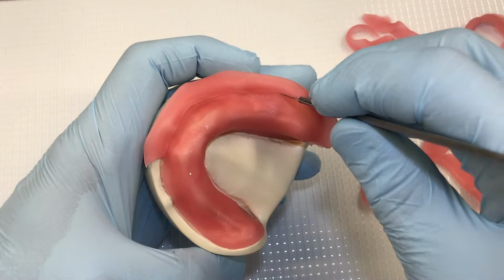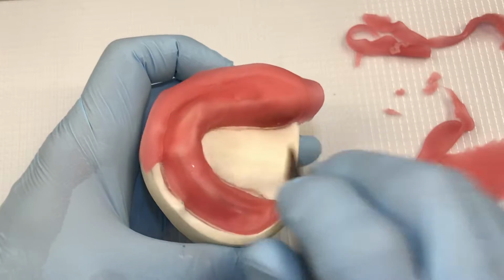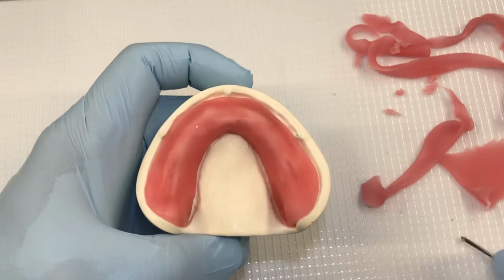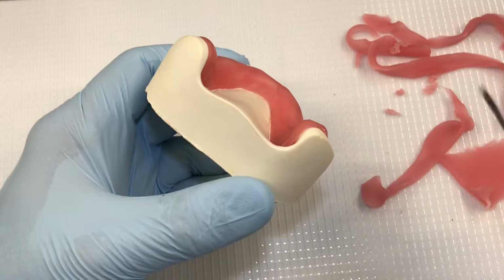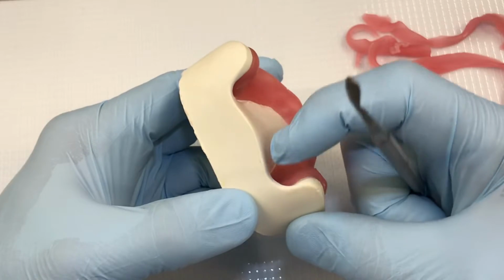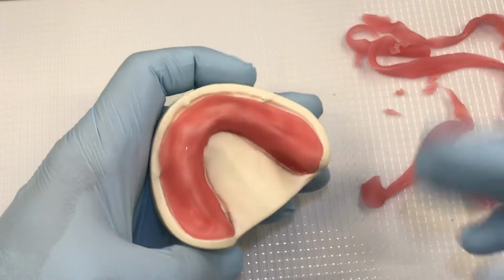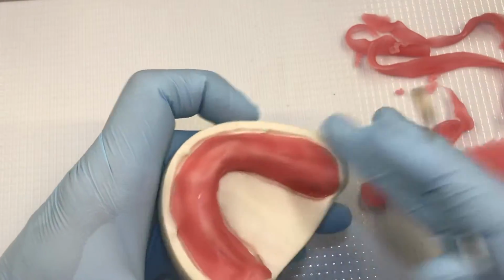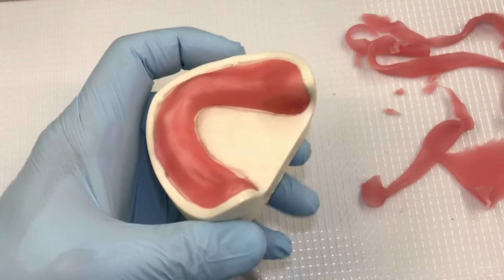And as you're cutting through the material, you can feel your blade having a bit of a resistance as it cools off. So you have to go back and heat it and put it back and continue to the next section. If you notice back here, as I was cutting it, I created a little bit of space. You need to go back in and readapt the material for obvious reasons that we mentioned already. Little piece of stone there I got to remove.